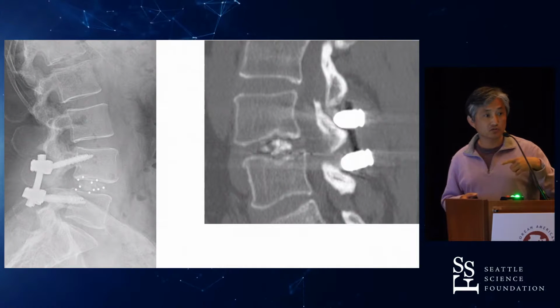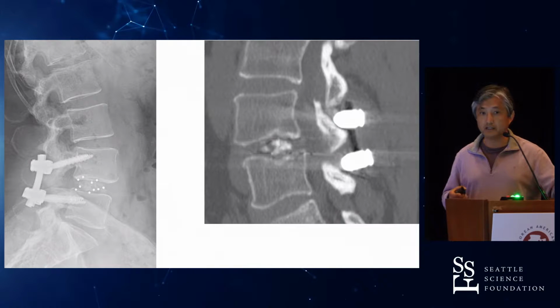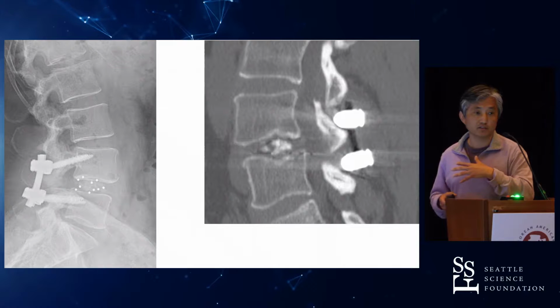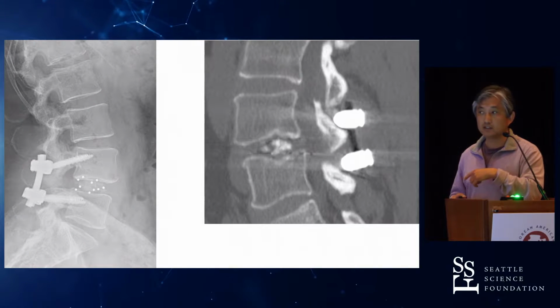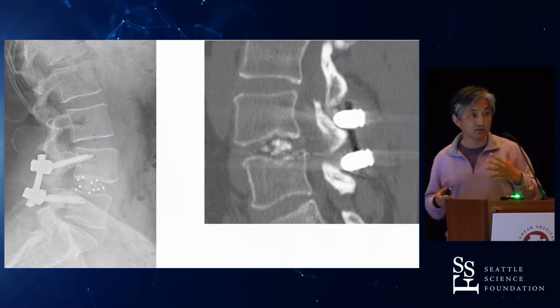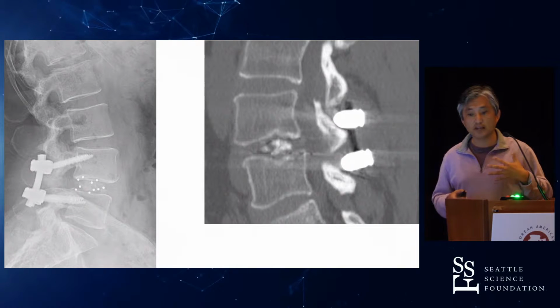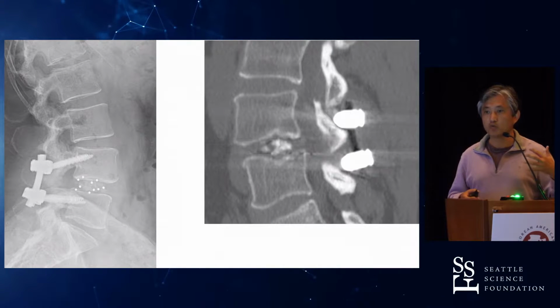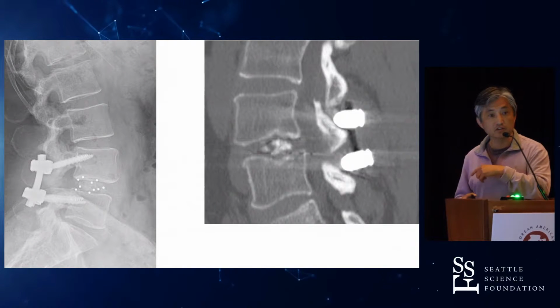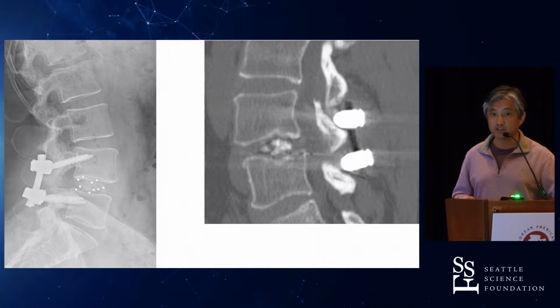But yeah, this patient comes to your office and says, "Thank you, doc. I love you. You fixed my back. I'm doing great," right? So I have a lot of patients like that in my practice, but I certainly do worry about the fact that this patient hasn't fused and wonder, perhaps a year and a half later, they're going to come back and say, "I need a revision surgery," right? So what can we do to improve fusion in our patients, and what can we do to our grafts that we stick in the interbody space to help that occur? That's where surface technology comes in.